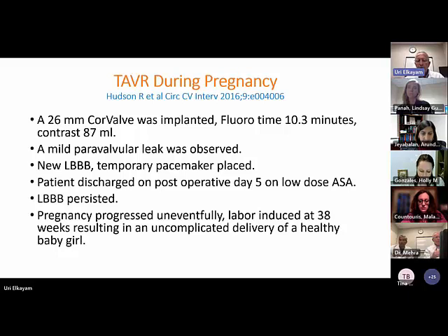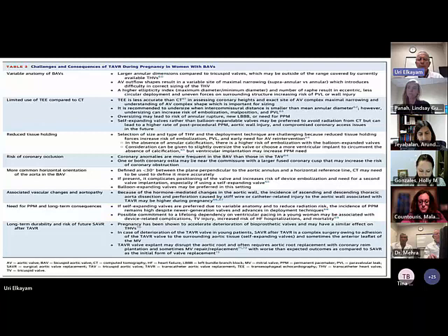The more important question that everybody has to ask herself or himself, does the patient need the procedure? Does the patient need the procedure? And then we definitely have the option of a TAVR or valvuloplasty. We felt that it was really very important to educate physicians about the potential challenges doing a TAVR during pregnancy in a patient with a bicuspid valve.